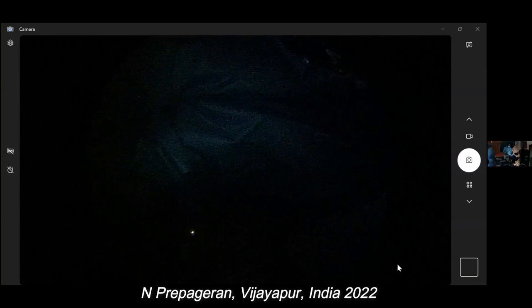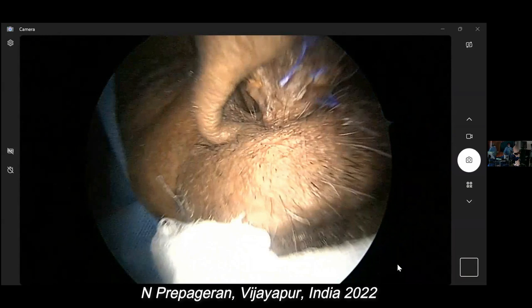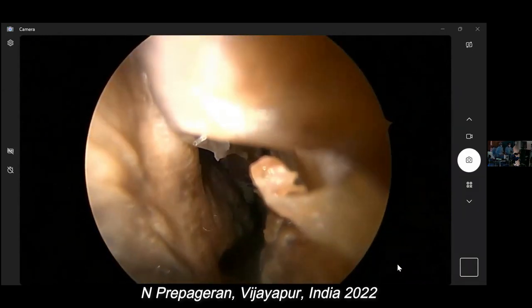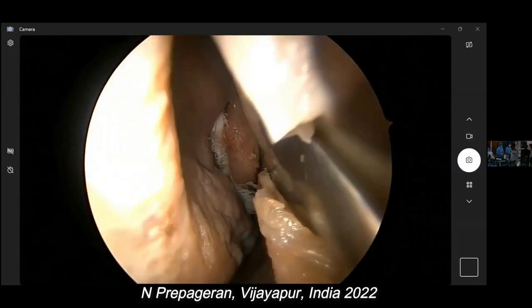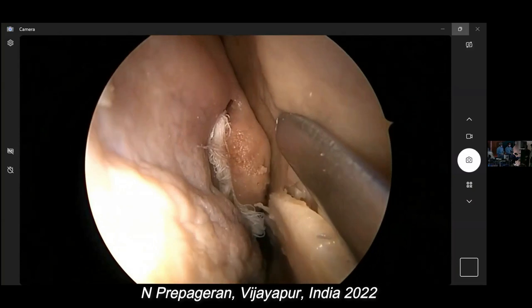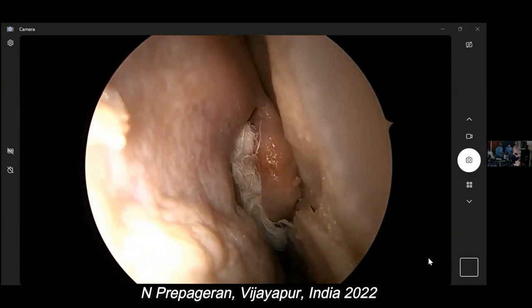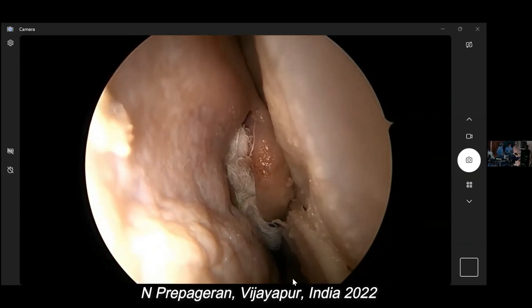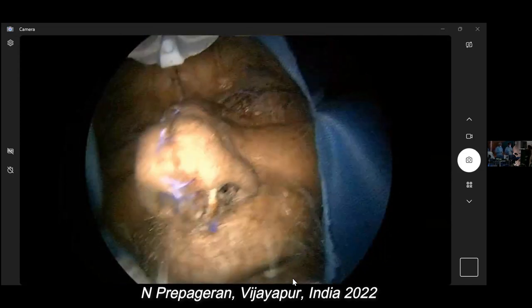It's working? Yes. Perfect. Sir. Let's go. Okay. Now it is coming, sir. Freer elevator. So here you can see this elevator. You see the septal flap is already been cut because of the previous rhinoplasty. So what I've done is, Blakeslee, I have packed the middle meatus exactly like how we will do a surgery. So let's do the dissection exactly like how we will do a surgery.